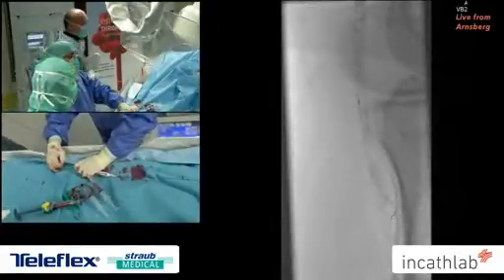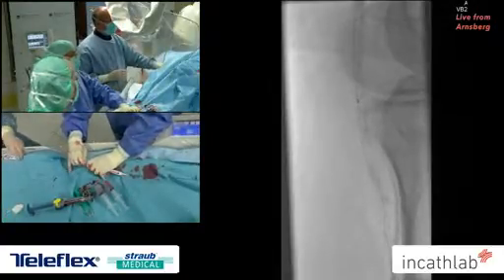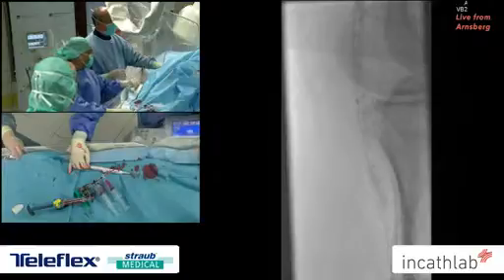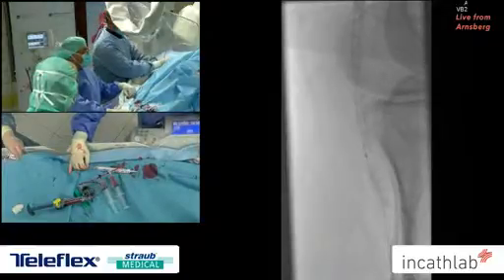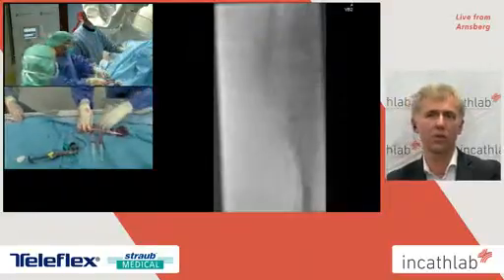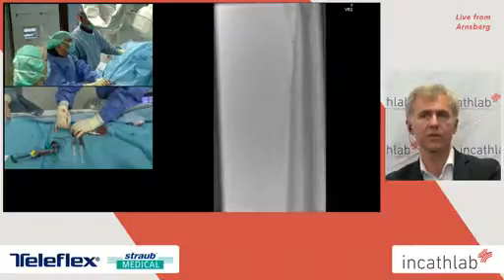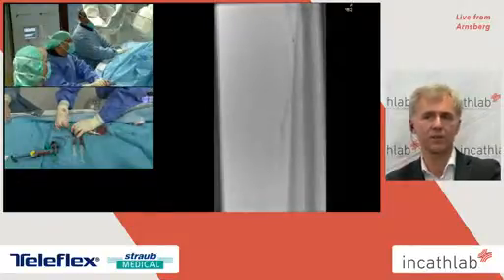And just to make it clear, as you said, which is very important, if you choose a very short balloon, you have the opportunity to give a super selective angio shot, just not to fill collaterals, but just to see whether you have already re-entered the true space, or if you're still subintimal or far away from the vessel you want to treat.